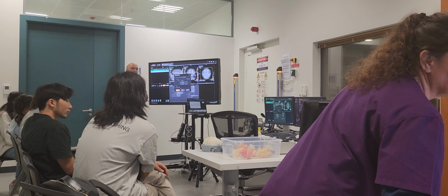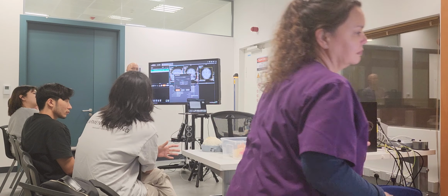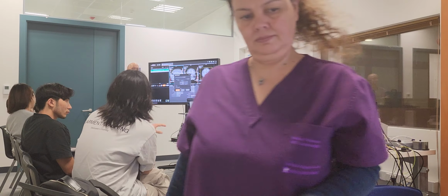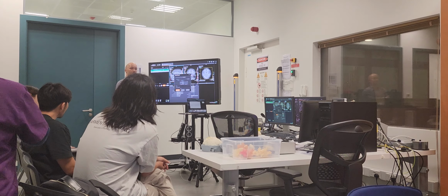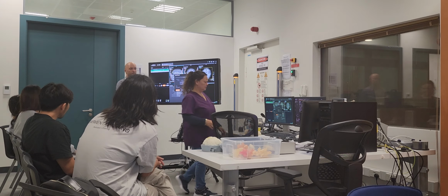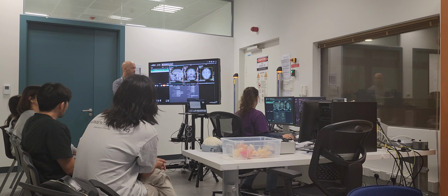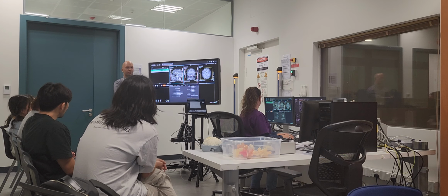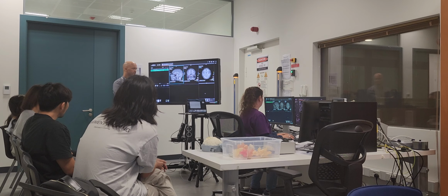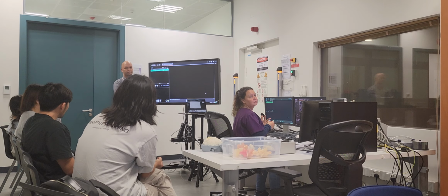Because in NMR we have like 5 scans, 15 scans experiments, like 1,000 scan experiment to enhance resolution. To enhance signal to noise. Yes, that's averaging. So yes, we do averaging. I think the anatomical scan we're doing 2 averages, but yeah, we do averaging all the time. The functional scans, we do just a single average, so we don't waste time. There is always a balance between resolution and signal to noise.